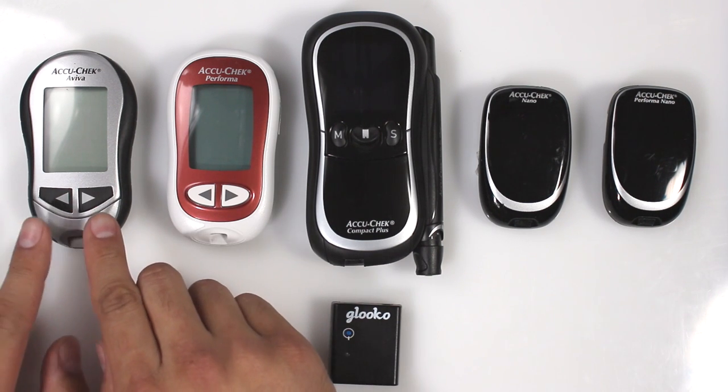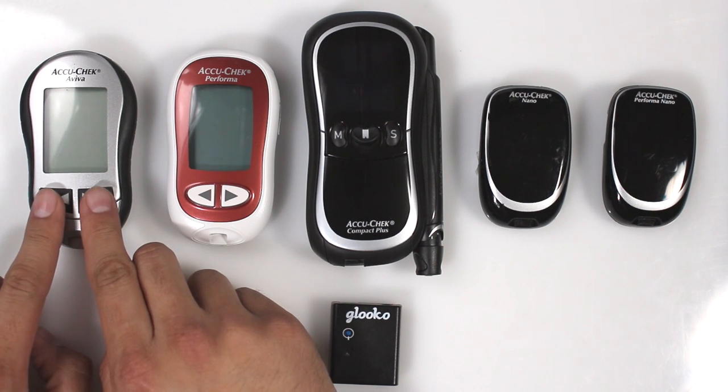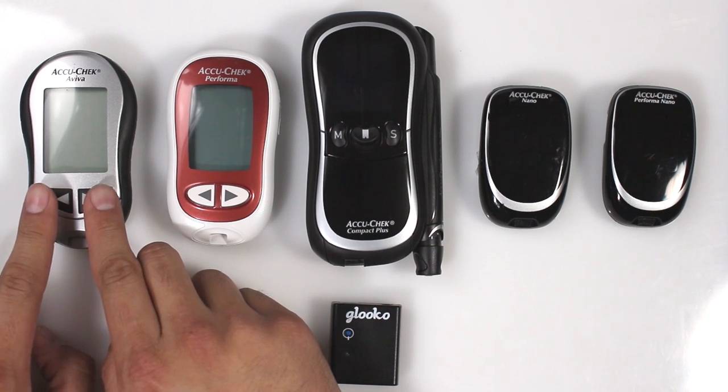To put these meters into Data Transfer Mode, press and hold the left and right arrows for 2 seconds until you see a Sync icon appear on the screen.